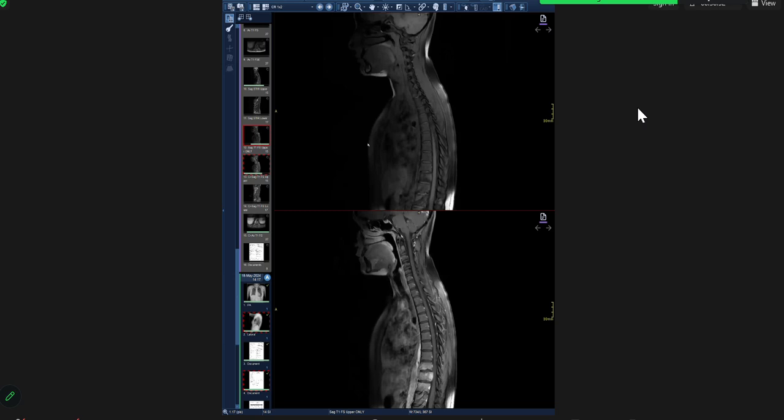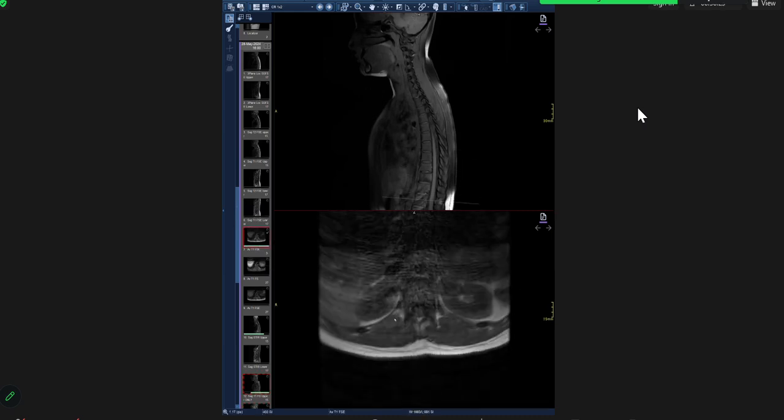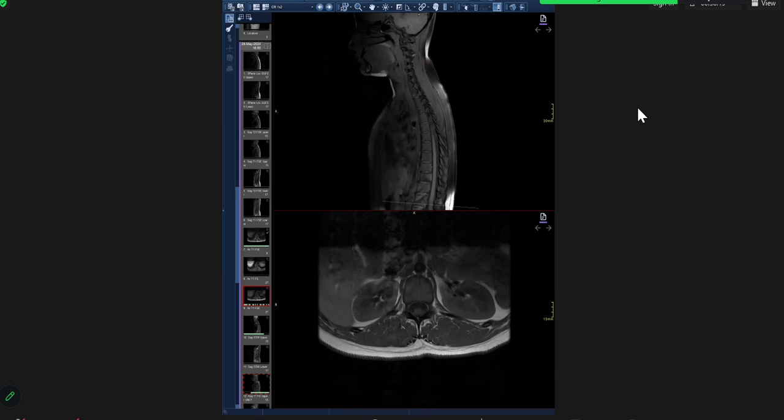So you really need to make sure that you image the entire spine to rule out other involvement, because in the lumbar region, you know that the psoas abscesses are very common, right? So you need to rule that out. Is there any other involvement?